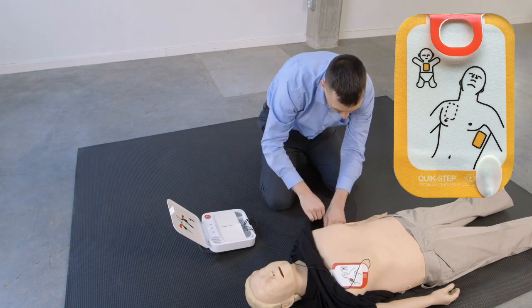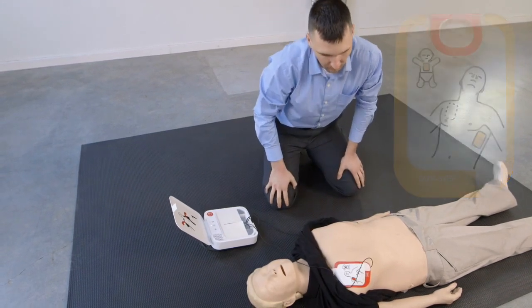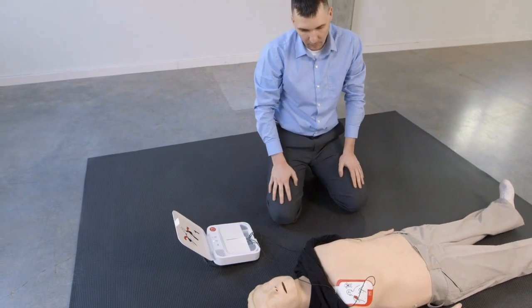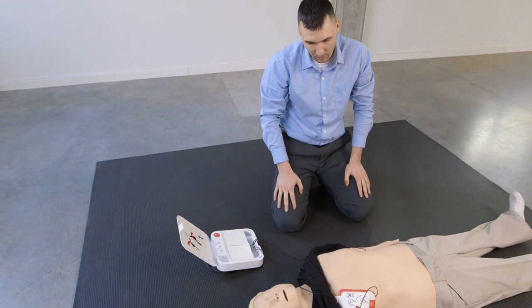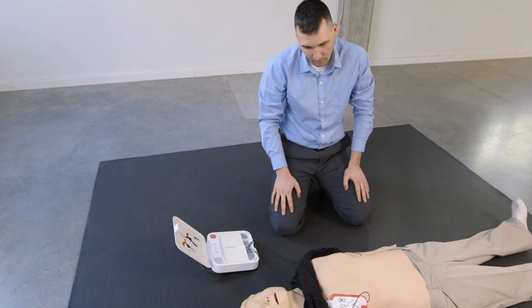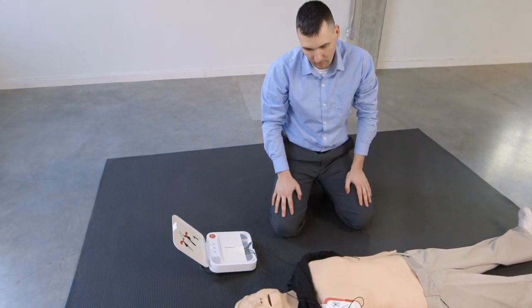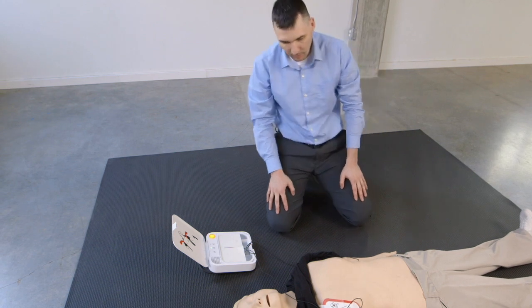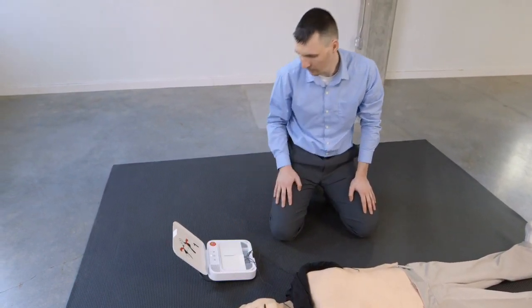Sätt fast elektroderna på barhud, precis så som det visas på bilderna. Rör inte personen. Analys pågår. Förbereder defibrillering. Rör inte personen. Tryck på blinkande knapp nu. Defibrillering levererad.